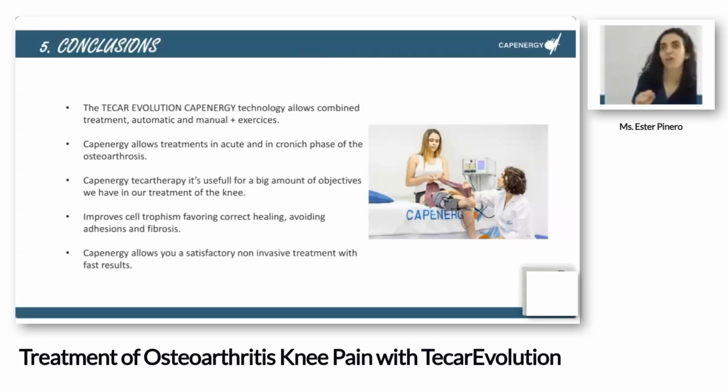You are not only treating the pain, or you are not only treating the inflammation. No, you are treating pain, inflammation, trophism, stimulating the collagen if you have scars, or if you have limitation of movement, to make these ligaments more flexible. Then there are many objectives you are treating that are useful for it. And another thing is that it improves the cells' trophism, favoring tissue healing and avoiding adhesions and fibrosis.